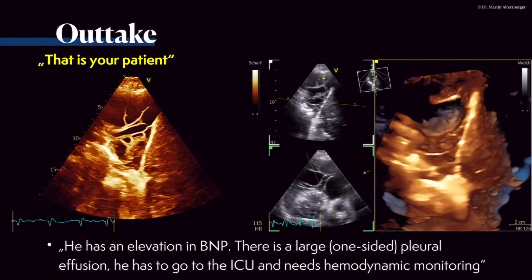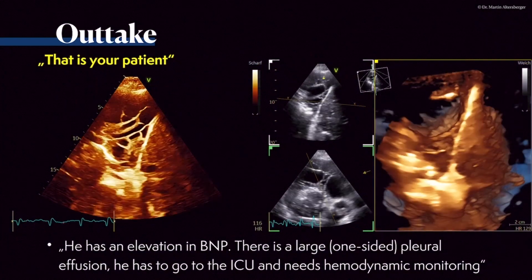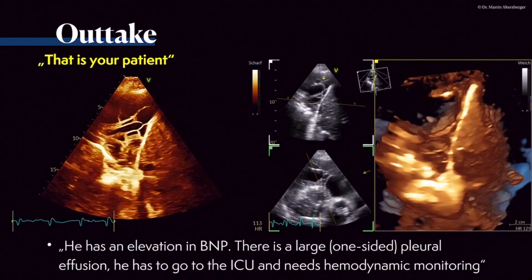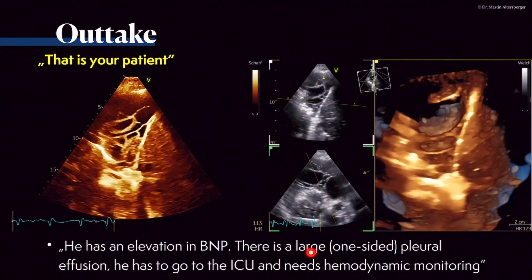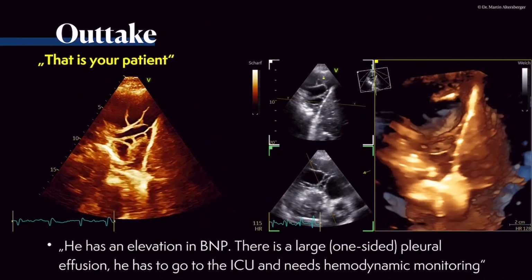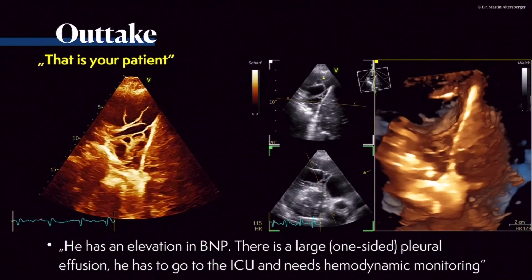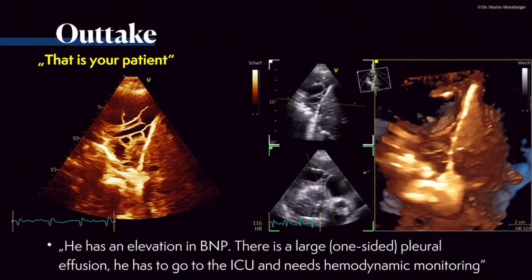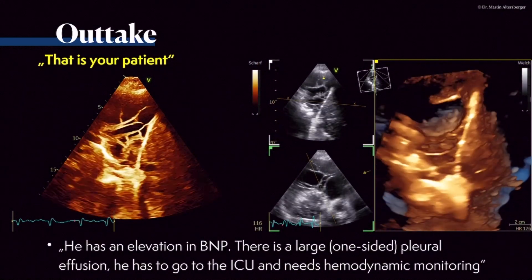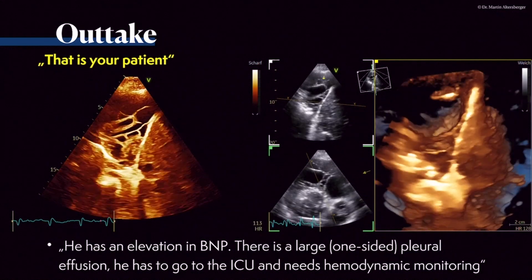An outtake I want to present you, there's a patient in the emergency department. The patient has elevation of BNP levels, so NT-proBNP is mildly elevated, and there's a large pleural effusion, and this has to be a patient for the ICU. This patient needs hemodynamic monitoring due to this huge pleural effusion. The pleural effusion was one-sided, so it was only on the left side, which is not per se a cardiologic cause where you think immediately about the heart.